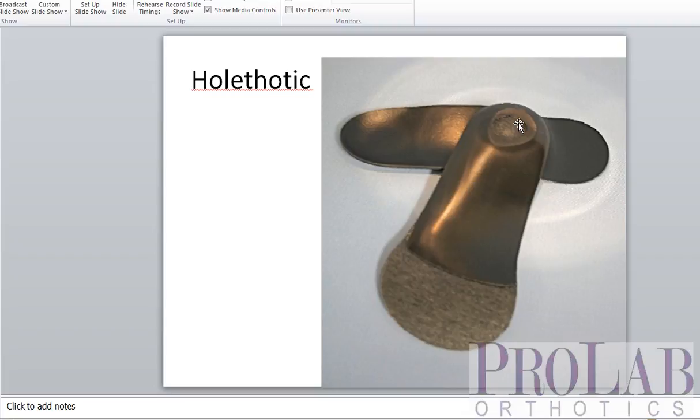It's not a particularly good device for heels because it is ground flat on the bottom — it tends to rock if you get it more than half an inch of heel. So really this is for dress flats. I also tend to use it a lot for soccer shoes and any shoe where I really want the heel to sit very low down in the shoe.